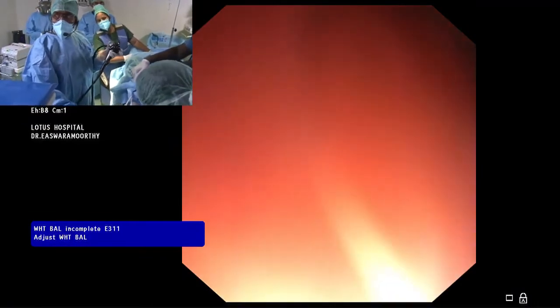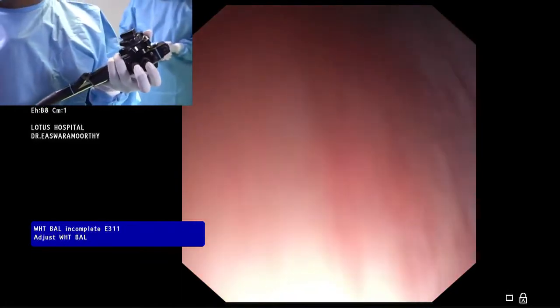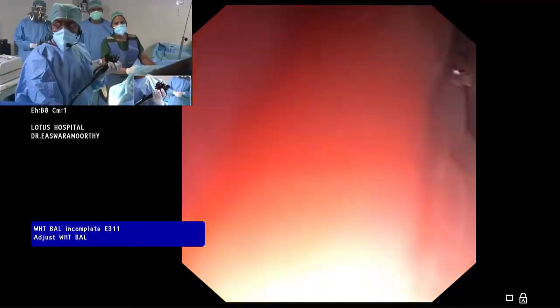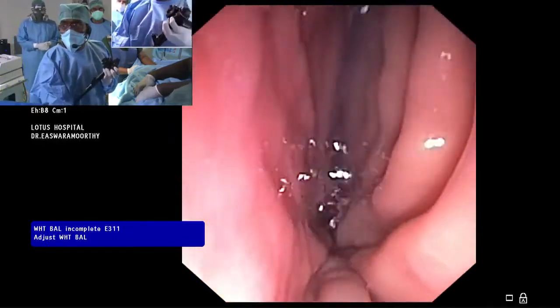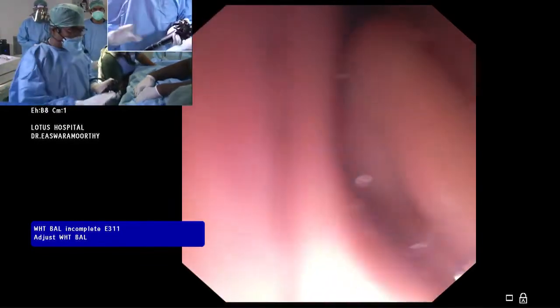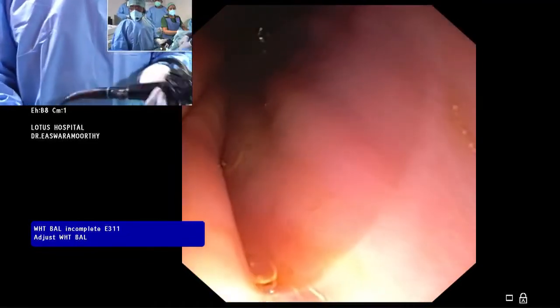And if you watch my hand and the big wheel, if you keep it a little away from you, you can see the esophageal wall. Otherwise, you are only seeing the side. As you go in around 40 centimeter, you just torque the scope like this. Then you will go along the greater curvature in the long route, until you reach and see the pylorus, he has to maintain this position. That is the secret.